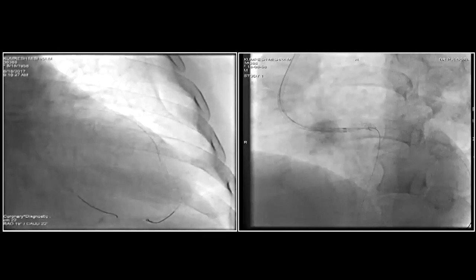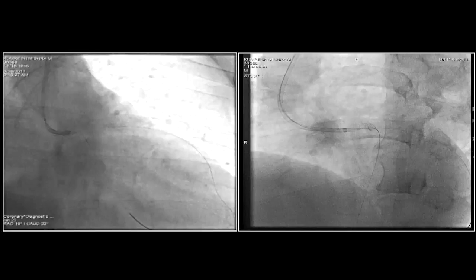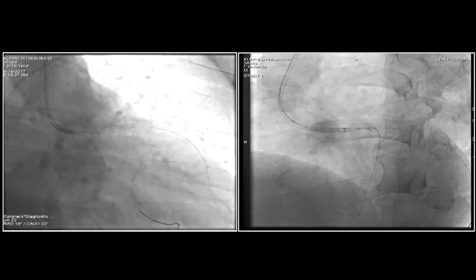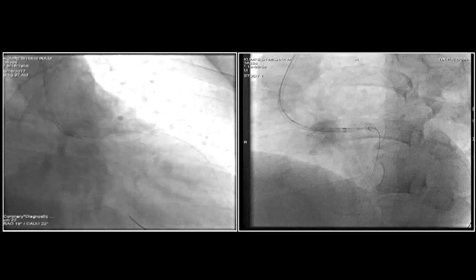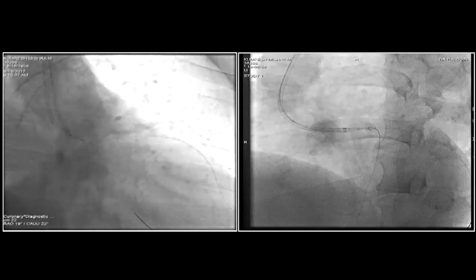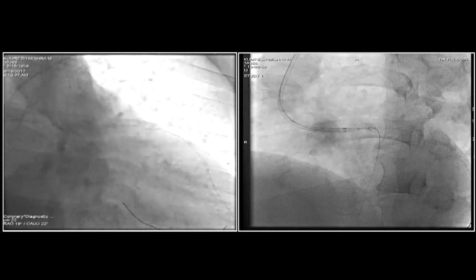No, I'll tell you something. I don't want to handle the stented part before POT at all. So that at least I can fix the stent on the wall and I don't get subintimal, means under the stent struts, when I start rewiring. Okay? So you will first do POT at all. And then only, he's doing 4 mm.